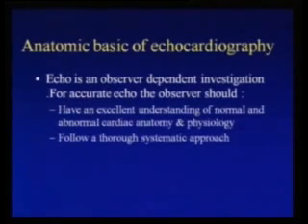So what is normal in fetal echo? What is normal after birth? The transition circulation in the later age group. What is the pattern of changing hemodynamics? We all should know to say whether it is abnormal or normal. And we should follow a systematic approach whenever we are doing a pediatric echocardiography.